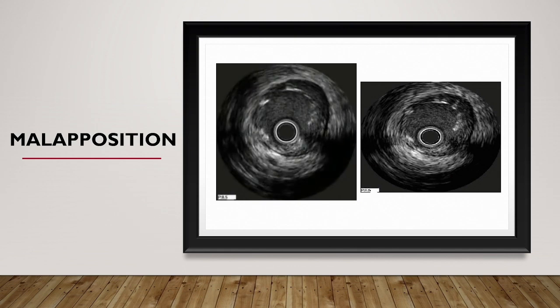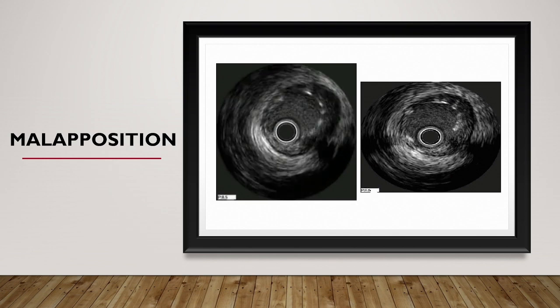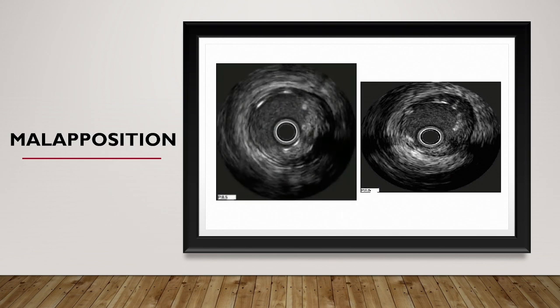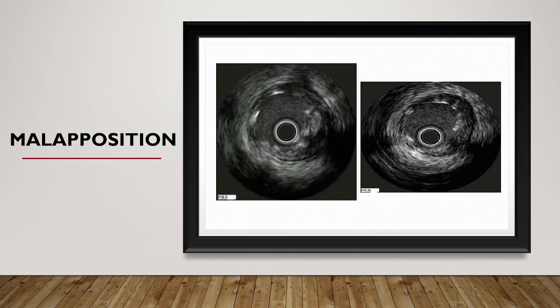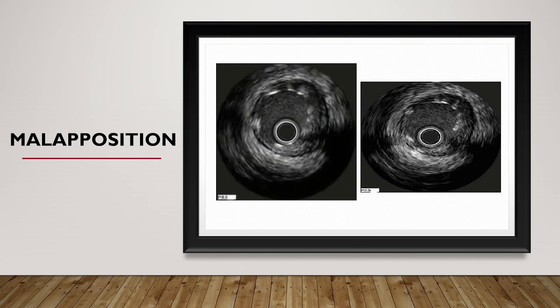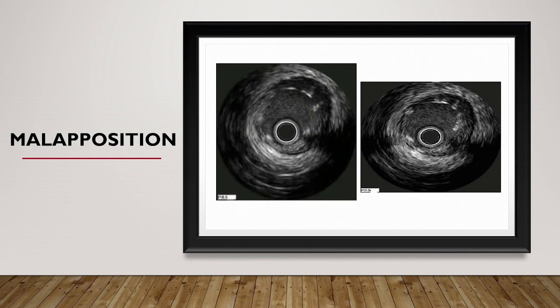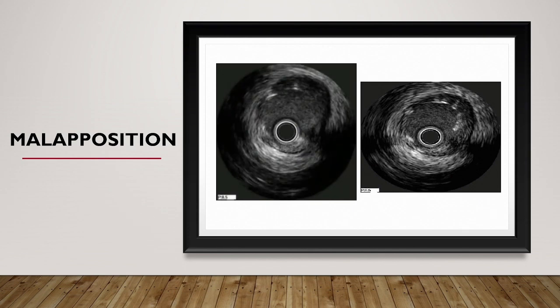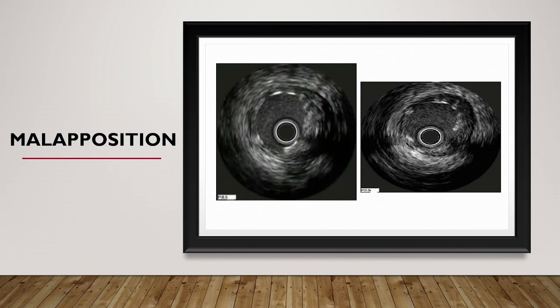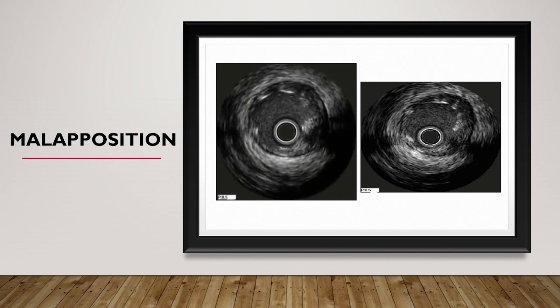And if we are putting a 3.0 stent in a 4.0 vessel, despite adequate dilatation, you may not reach 4 millimeters. So you may land into a malapposition, particularly in a large vessel like the left main or a bigger proximal vessel. A small segment of malapposition is not associated with any events, but in a second procedure, if your wire is likely to go abluminally, and if you don't recognize that, you can deform the stent totally and you land into a problem. That's where the problem starts.